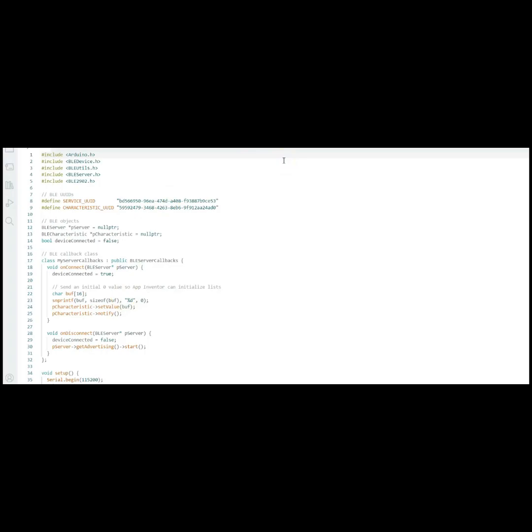Since we can't get an actual EMG sensor, this code makes fake EMG waves, and these are sent to the app to generate our chart. These are service UUIDs and then characteristic. These also have to match the MIT app to connect. This is to send a value to the MIT app so it can initialize a list.